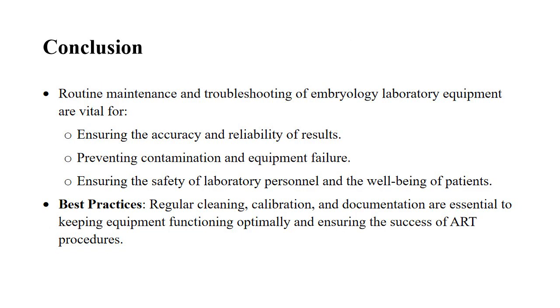Fourth, conclusion. Routine maintenance and troubleshooting are essential for ensuring that laboratory equipment functions optimally. By regularly inspecting, cleaning, and calibrating instruments such as microscopes, incubators, centrifuges, laminar flow hoods, and ICSI machines, laboratories can ensure reliable results, reduce the risk of contamination, and extend the life of valuable equipment.